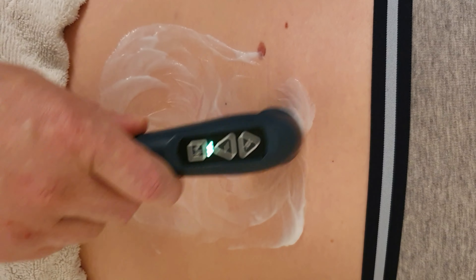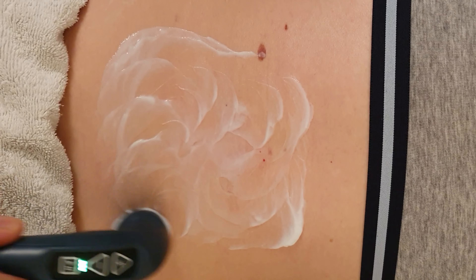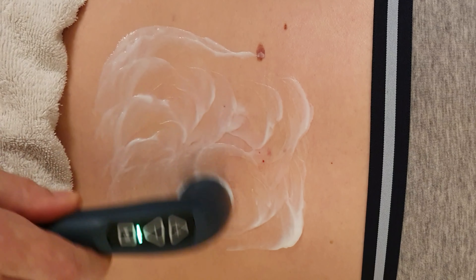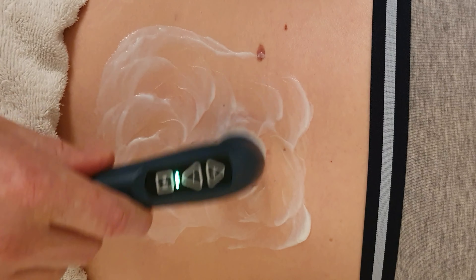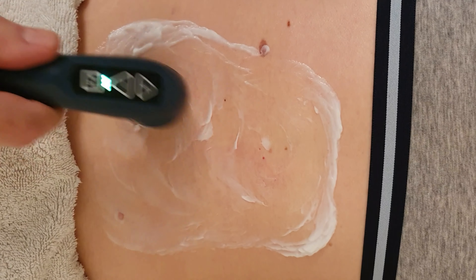People call this different things: muscle spasm, overactivity, hyperactive muscles. It doesn't really matter what you call it — basically it's when the muscles are too tight in this area. This is a long treatment, so I'm going to skip forward to the end of the treatment.